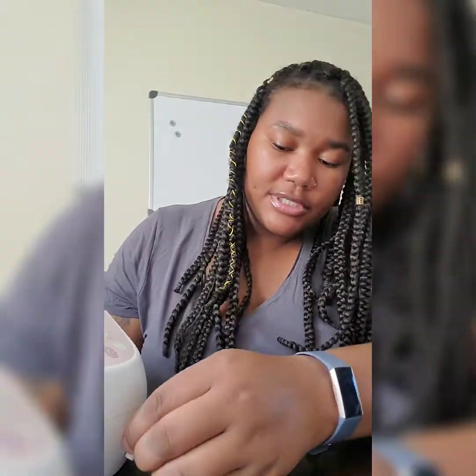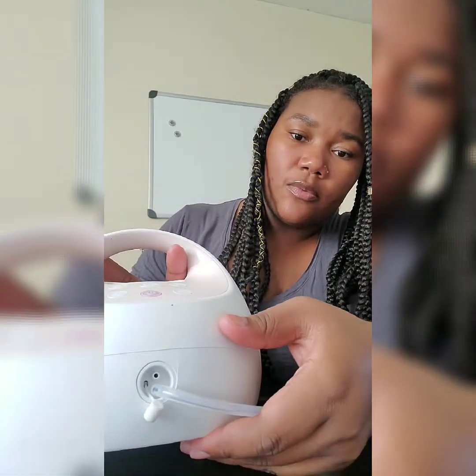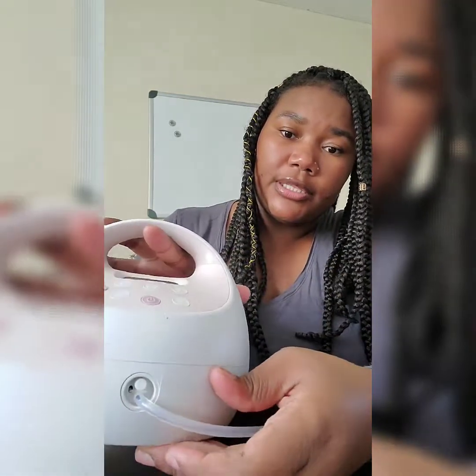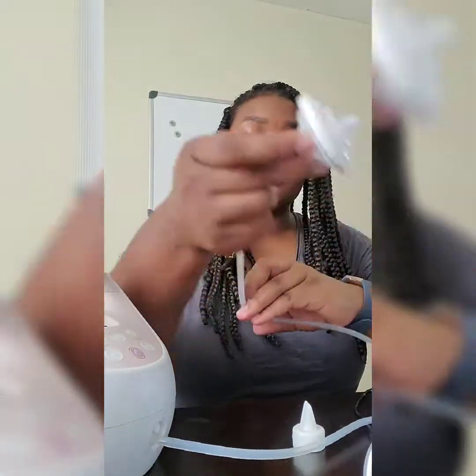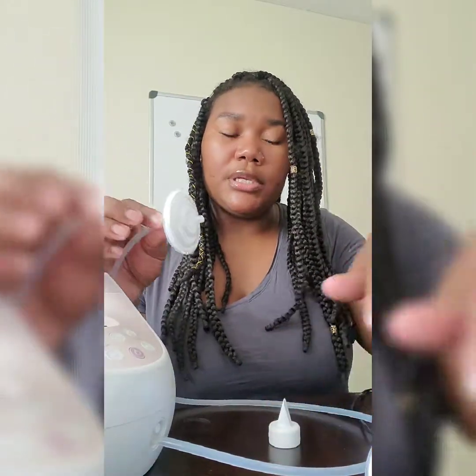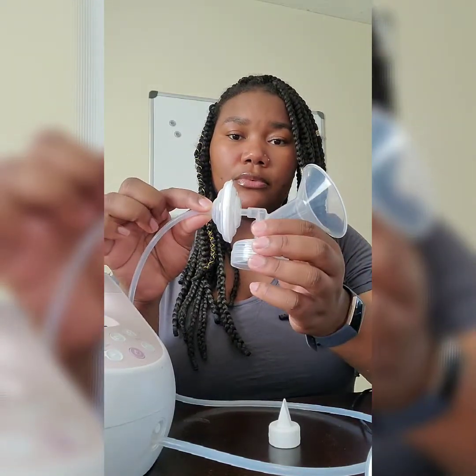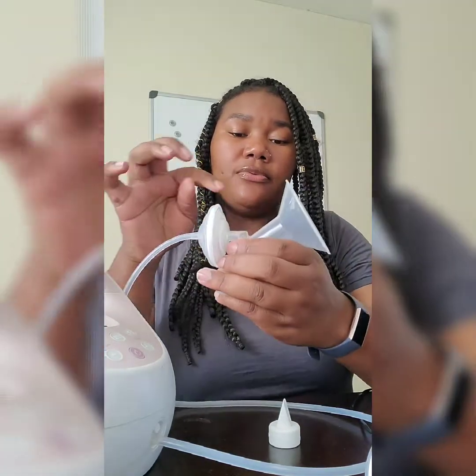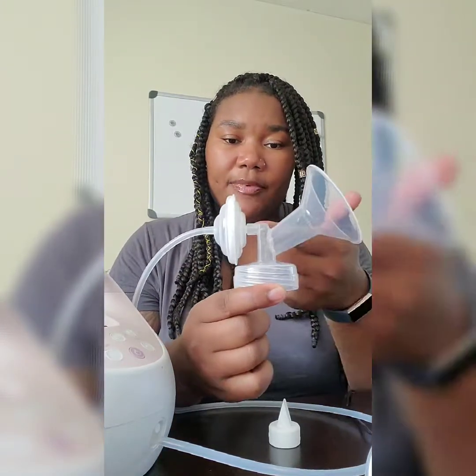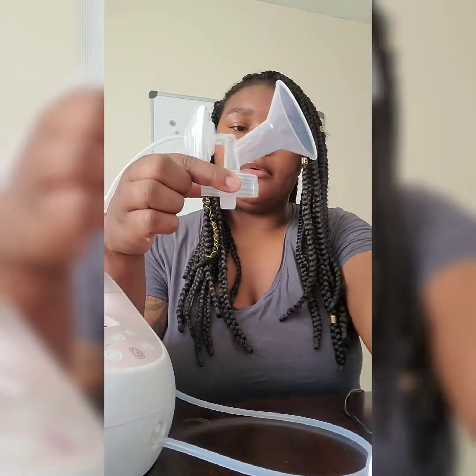I'm going to put it together quickly so you can see how it works. We put one piece on, then put the closure on — no big deal. Then I take this here and poke it right into this hole, and that's where the suction goes. This is how the sucking action happens. Now I'll put this last piece right where it belongs — and we're almost ready.